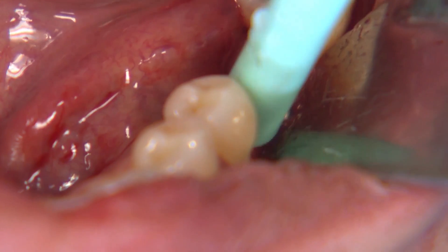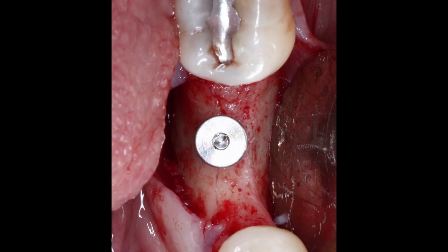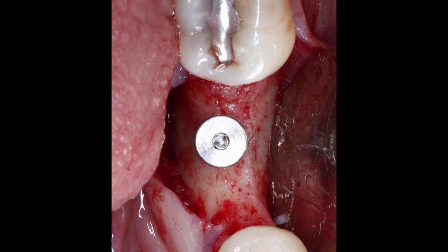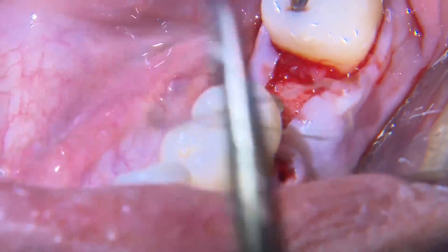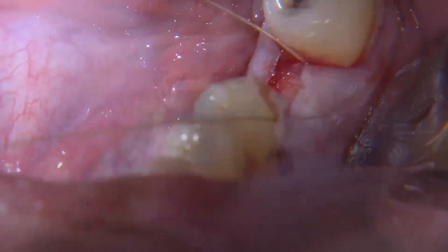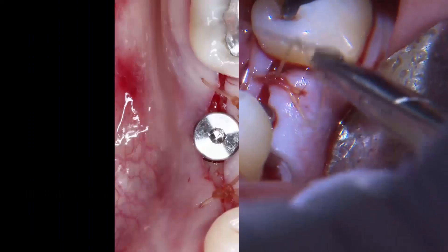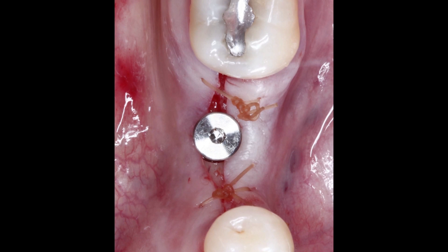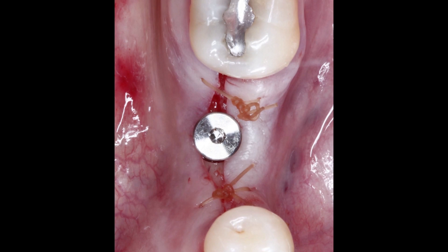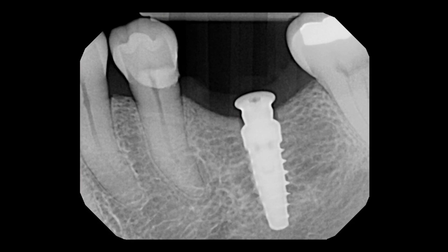Once I finish the procedure and place the implant, it's fairly simple to place two interrupted sutures. In this situation we use two interrupted chromic sutures. The tissue was approximated fairly well, and as you can see here, the implant is in place. Now the patient goes through a period of osseointegration before I bring the patient back for the final impression.